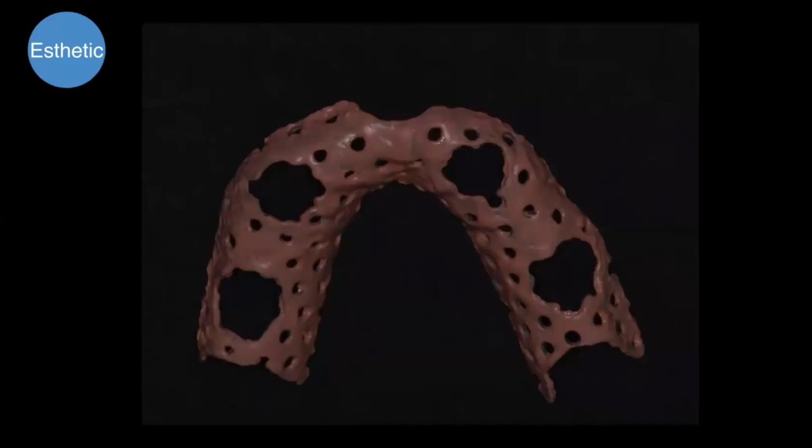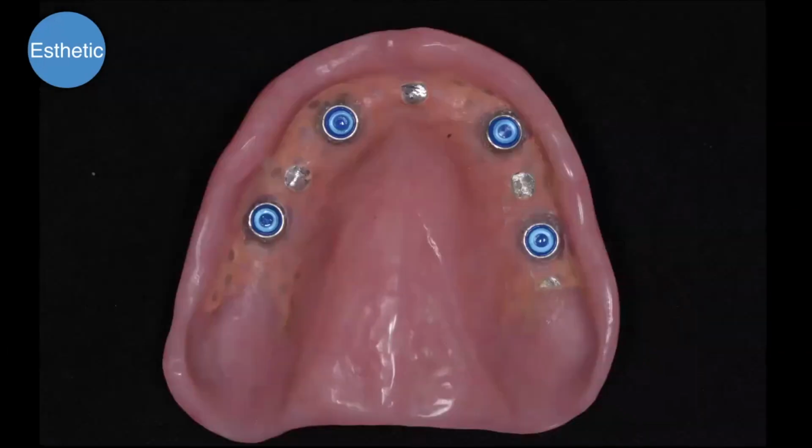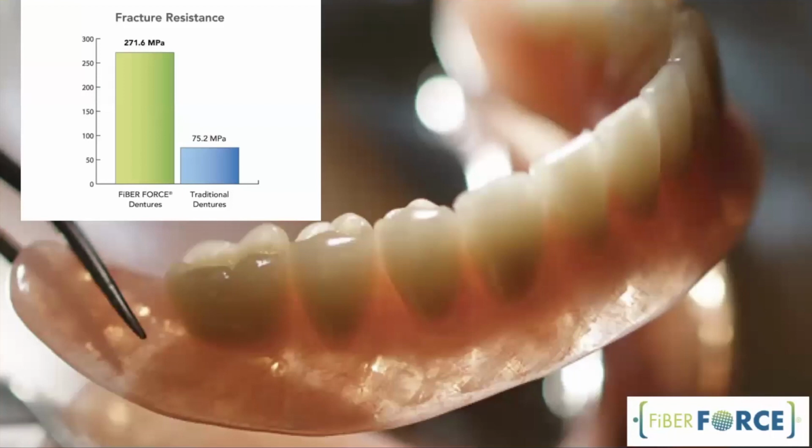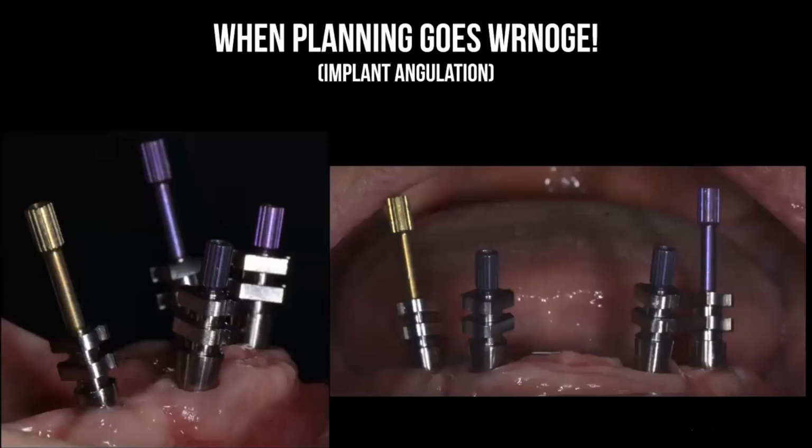This is another case, where you can sandblast and then apply primer and the opaque layer or pink composite on top of it. It shows less, especially on the cameo surface. Some people use glass fibers. Actually, studies show those are better than metal reinforcement. It truly reinforces the dentures, and it can reinforce up to 2 to 3 times more. Not only that, they are usually colorless, so it doesn't show through the denture, and they are also lighter, so you deliver a good service to the patients with a lighter prosthesis.